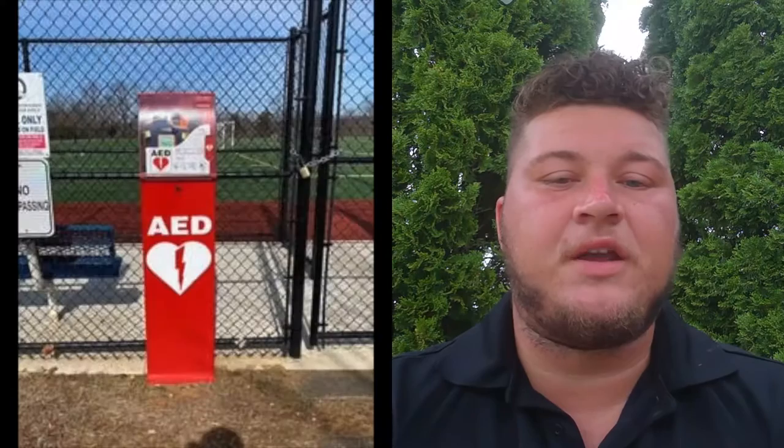Sudden cardiac arrest occurs suddenly and is the leading cause of death in the United States. So we should ensure that our parks and rec centers not only have AEDs, but that they are easily located by utilizing proper signage so that they can be retrieved and utilized as quickly as possible in the case of an emergency. First aid kits should also be easily located and easily accessible, ideally with or right next to your AEDs.